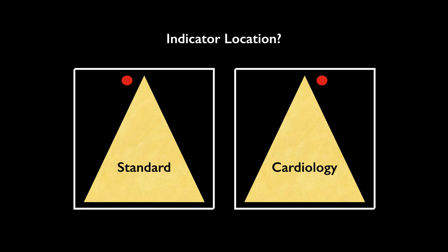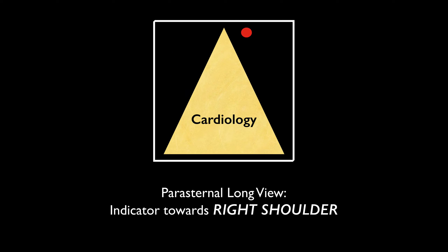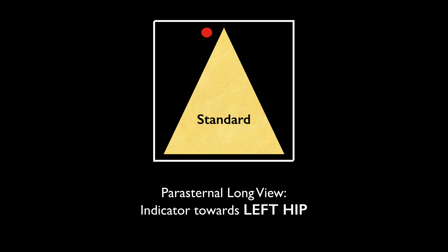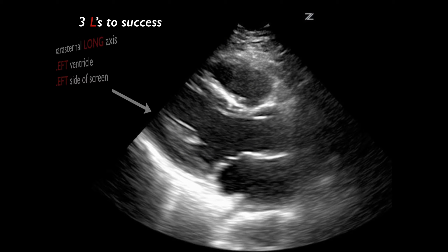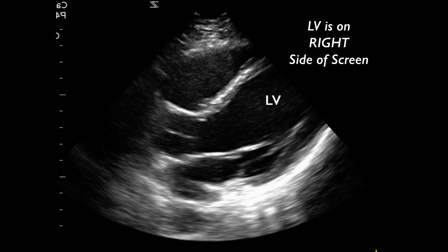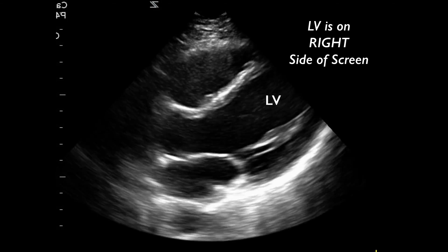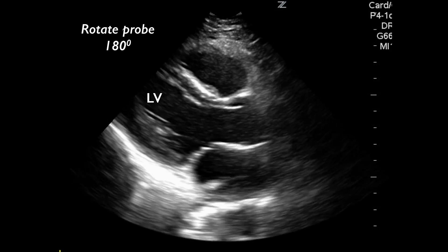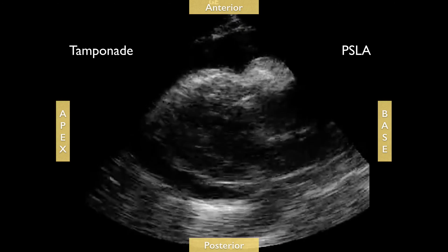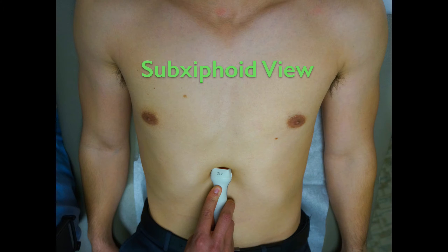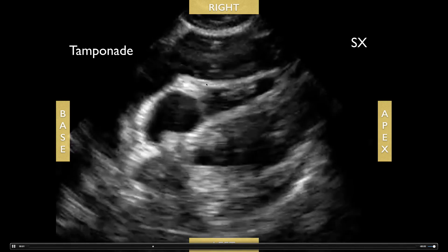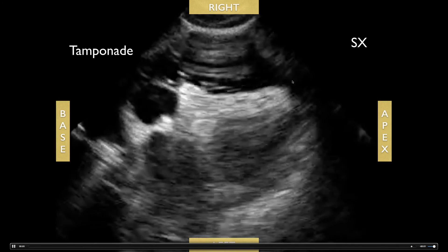You can also rule out pericardial effusion and tamponade. In cardiac mode the indicator goes towards the right shoulder, but in the standard FAST view, rotate 180 degrees so the indicator goes towards the left hip. Use the three L's: in the parasternal long axis view, the left ventricle is always on the left side of the screen. Here's a pericardial effusion and RV diastolic collapse indicating tamponade. For the sub-xiphoid view in the FAST scan, the indicator goes towards the patient's right side.